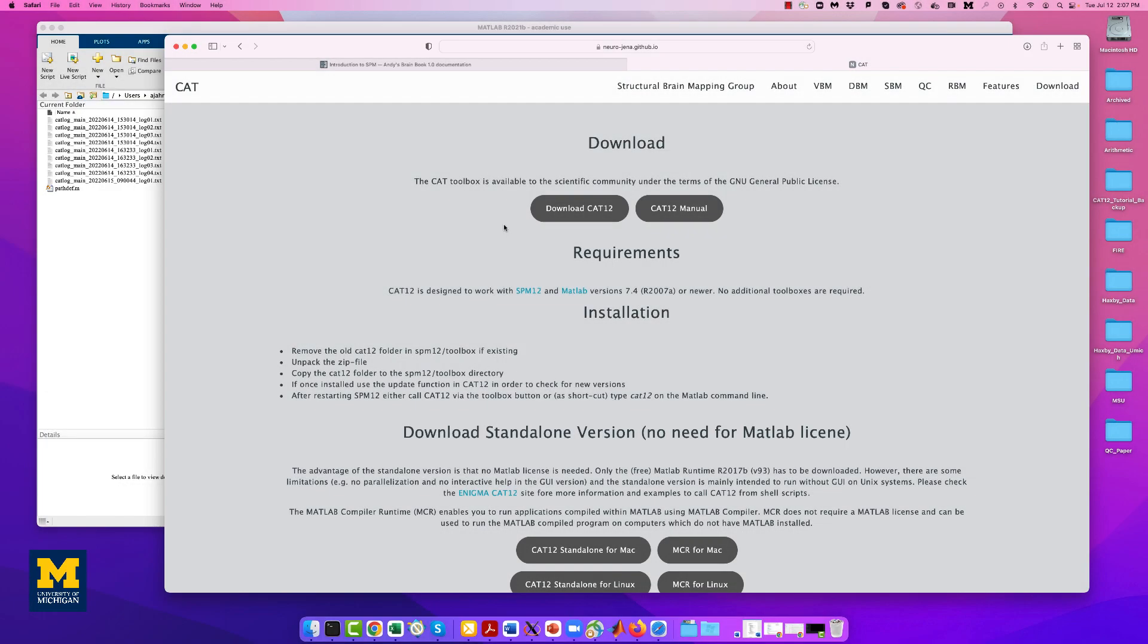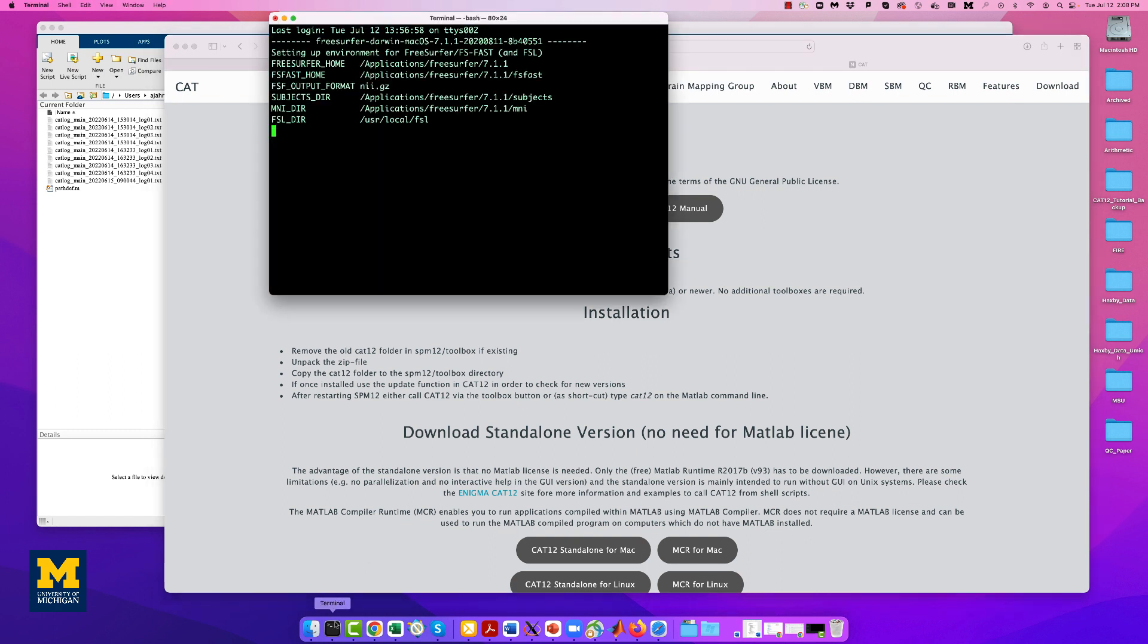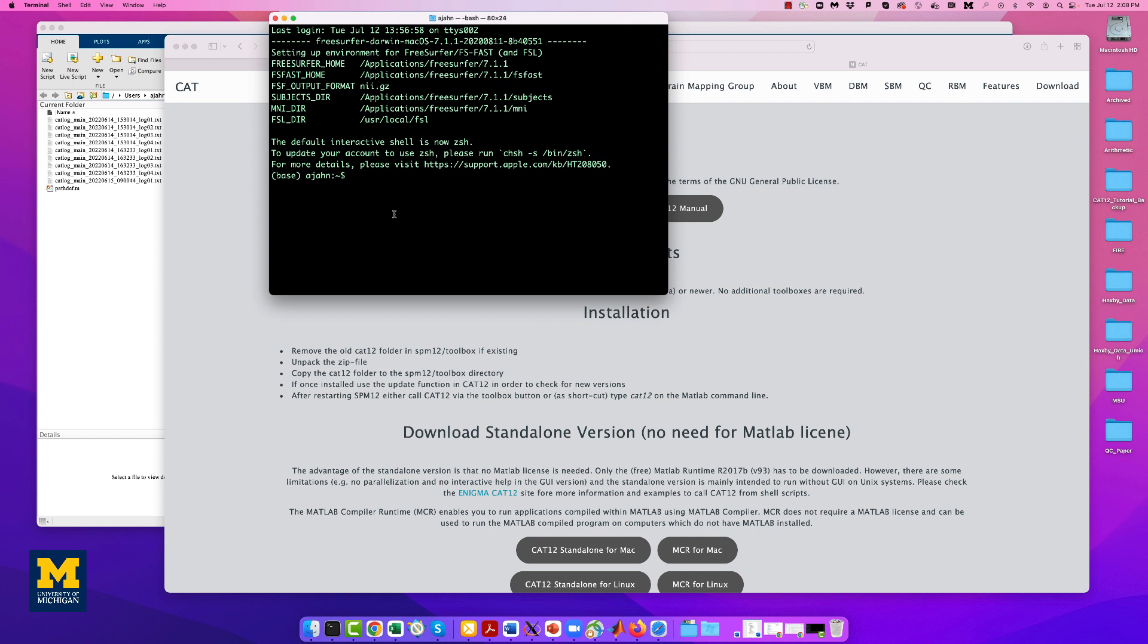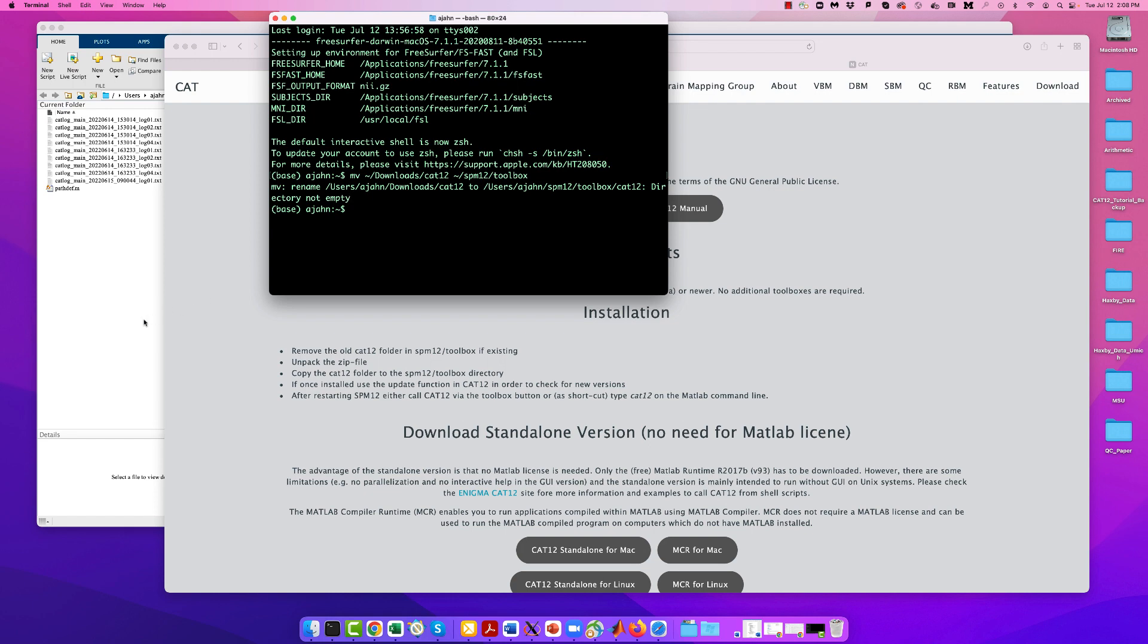When CAT-12 has finished downloading, open up a terminal. Assuming that SPM-12 is in your home directory, type the following: mv tilda slash downloads slash cat-12 slash spm slash toolbox. I already have it installed, so it's going to give me this message about the directory not being empty, but it should work on your computer.